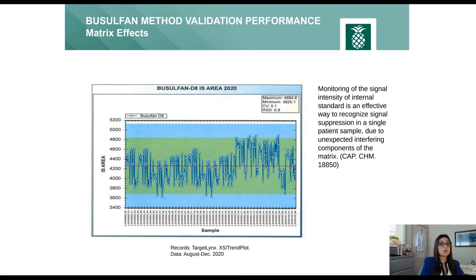Using the MassLynx software, we create a graph for routine monitoring of the area of the internal standard. A characteristic deviation of the internal standard area of the calibrators, QC, or patient samples can indicate an error in sample processing or signal interference caused by matrix components. The use of a stable deuterated internal standard helps control variability in a quantitative assay.